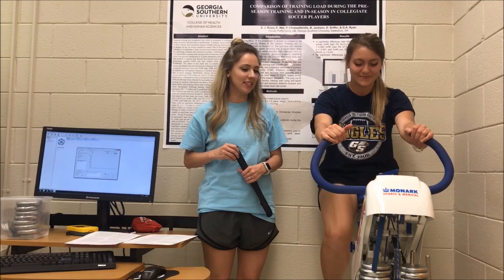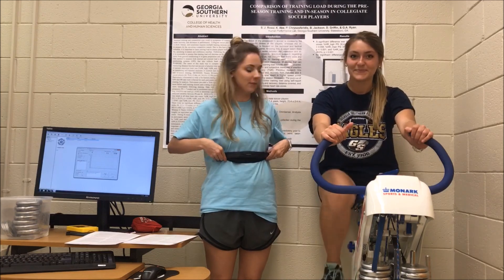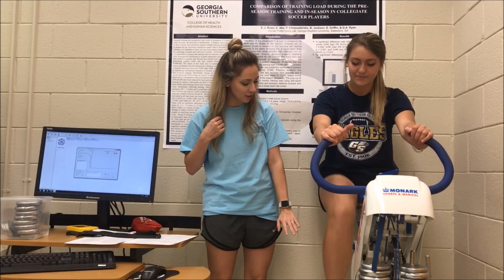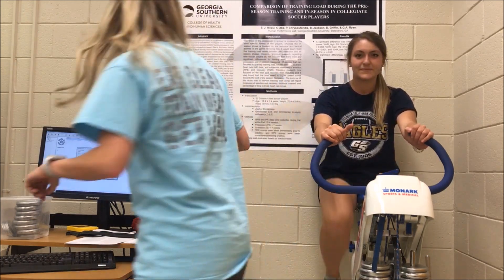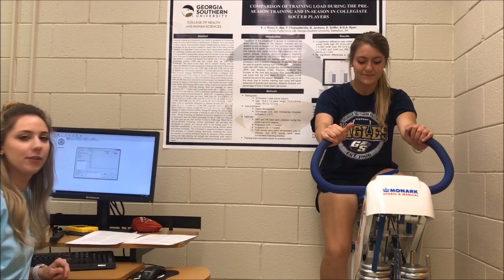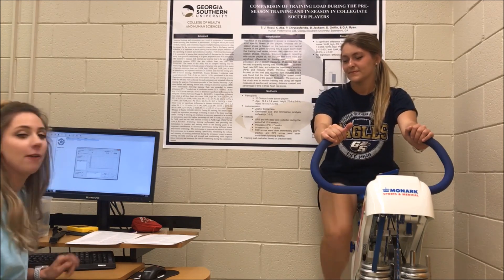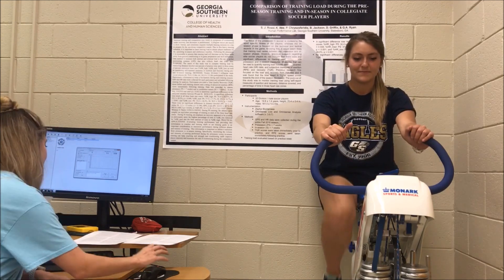Now that the bike has been prepped for testing, we have also ensured that the participant is prepped as well. The participant is wearing a heart rate monitor around her rib cage, tucked up under her sports bra. We have also ensured that the seat height is at a proper height for the individual, at about a 5 to 25% bend when her leg is fully extended. She is cycling between 50 and 60 revolutions per minute and has been cycling for approximately one minute. During the warm-up, we want to make sure she does 5 all-out sprints between 4 and 6 seconds so that her body and mind are prepared for the test itself.